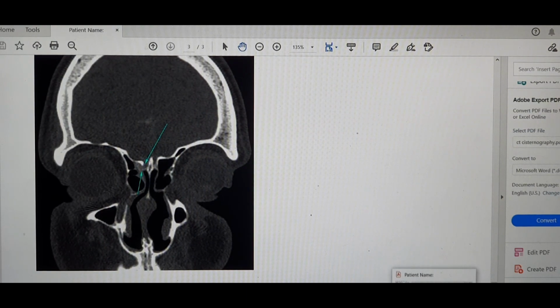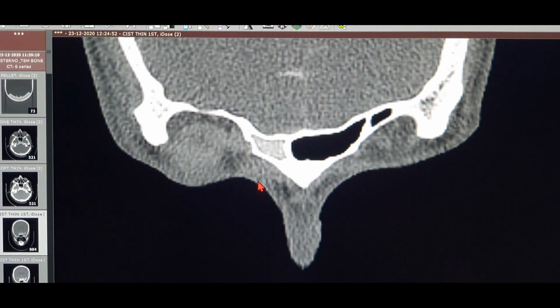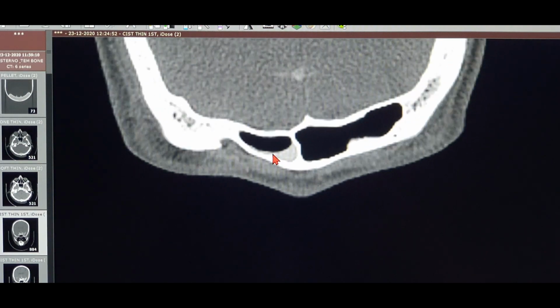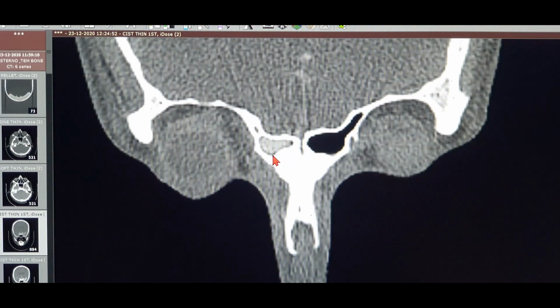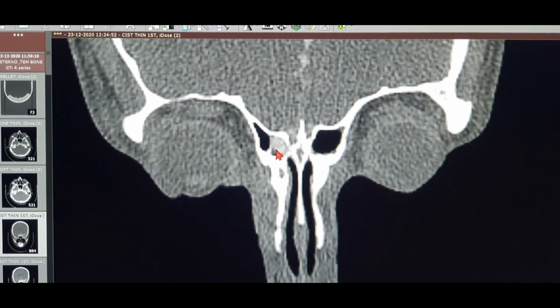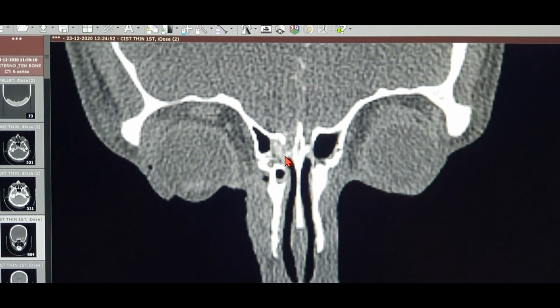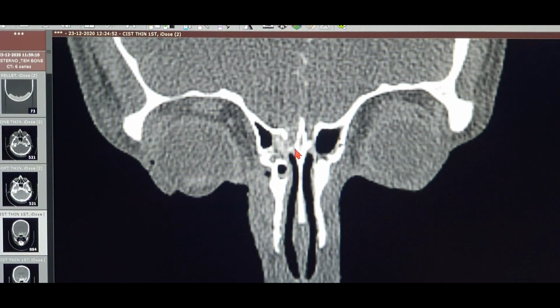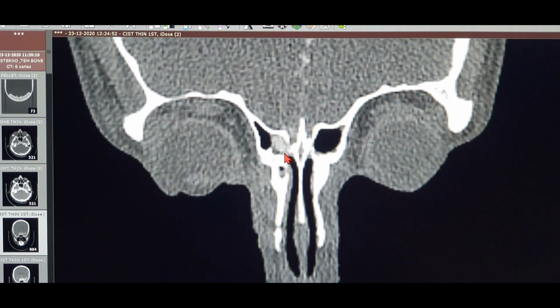Now I'll show you the dynamic CT scan. As you can see, this is the patient's right frontal, this is the left frontal, the left being more dominant, I guess. The right is showing opacification, as we can see over here, and we are going from the anterior to the posterior aspect. All the way throughout, the frontal sinus is having opacification on the right side, and roughly in this area you can typically see a bony defect. There's a clear-cut bony margin which is deficient over here, and you can see the collection in the frontal sinus happening over in this period.